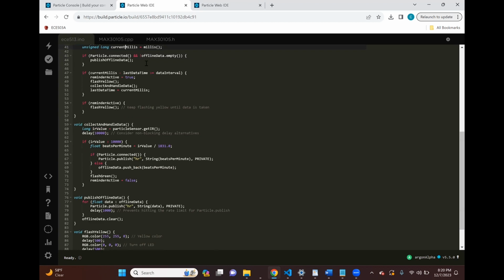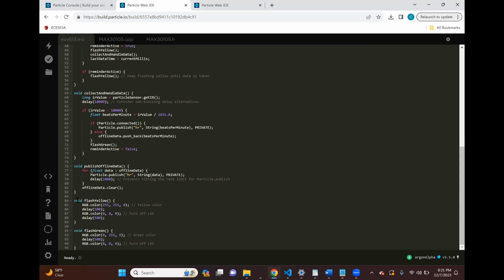Another function called above, when we first check if the Particle is connected and if the offline data storage was empty, here we have the publish offline data function, which just publishes this string data when the above condition is true. And two more functions are just the flashing yellow and the flashing green LED.